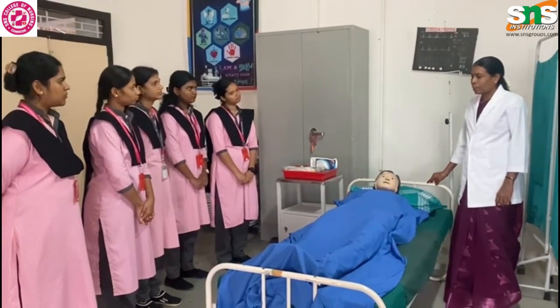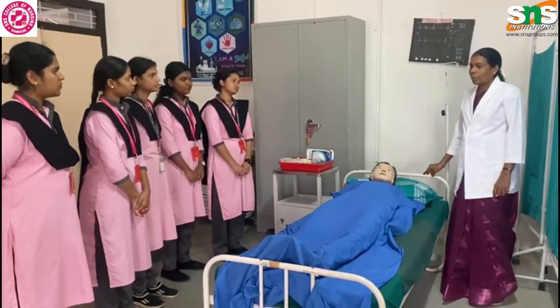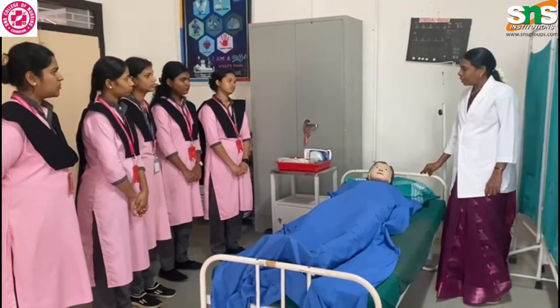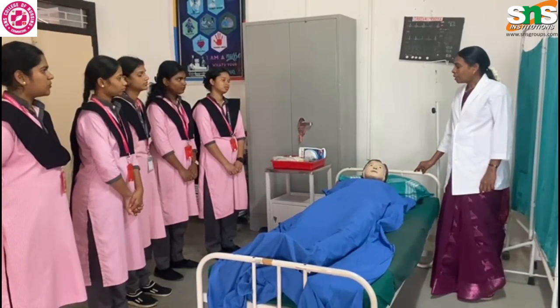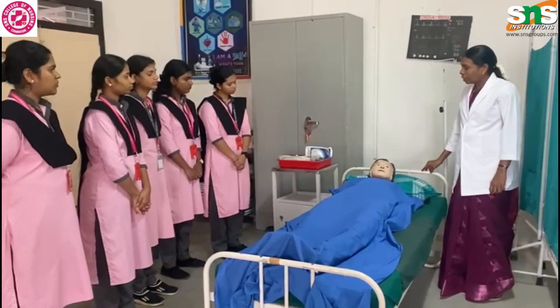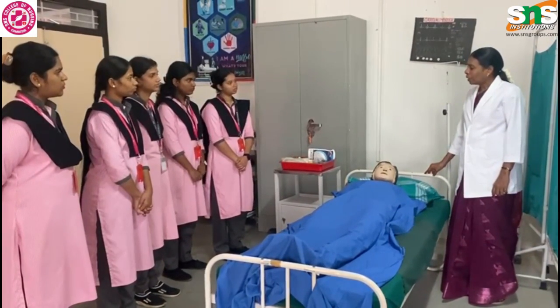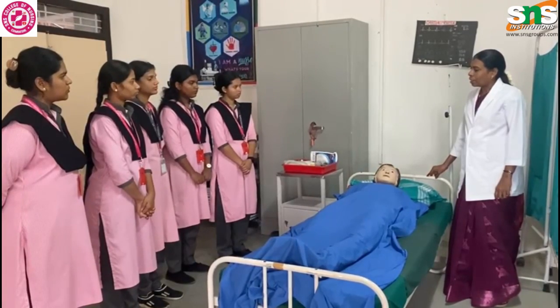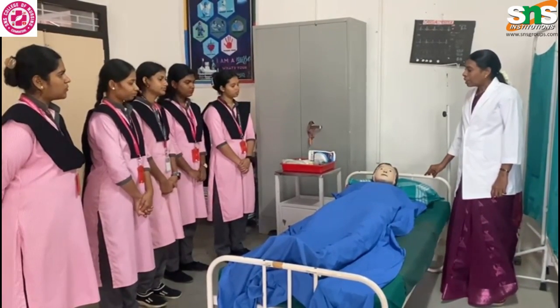We are going to demonstrate about the NG tube feeding. My kids are here to demonstrate about NG tube feeding. Each and every person has a different task. By using the various articles, we are going to demonstrate what is the purpose of doing this feeding and what are the indication, contraindication, everything. They are going to tell about each and every one step by step.